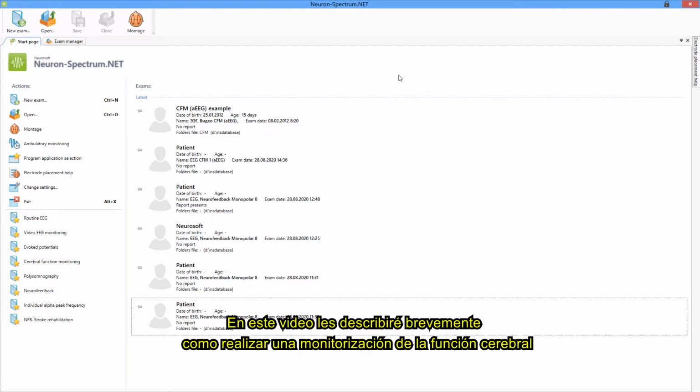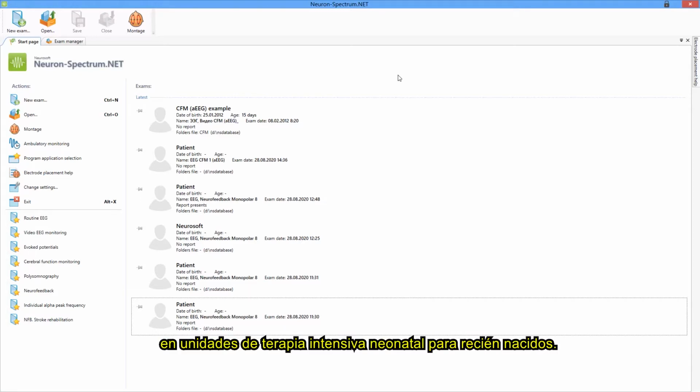In this video, I'll briefly describe how to perform cerebral function monitoring in neonatal intensive care units for newborn babies. I run neuronspectrum.net software with default settings.